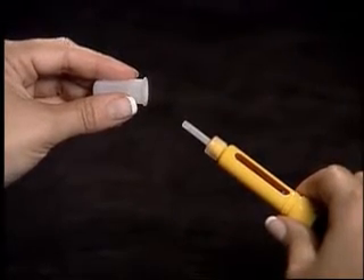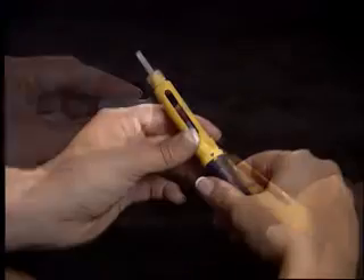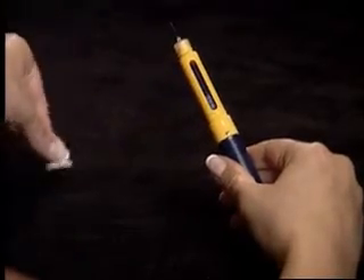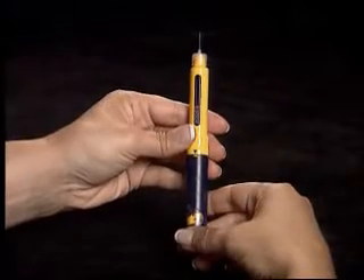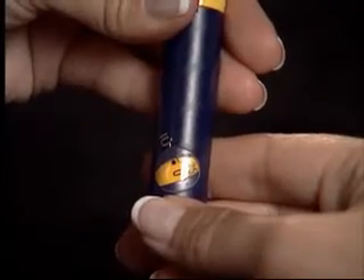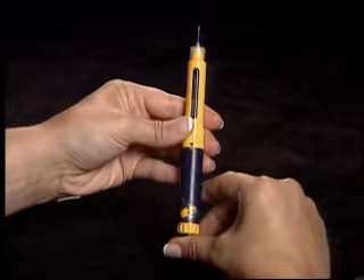You will need this shield to remove the needle when the injection is complete. Carefully remove the inner needle shield, and with the needle pointing upwards, you should see a droplet at the tip of the needle. If you do not see a droplet, turn the dosage knob until you hear a click. Push the injection button and you should see a droplet.